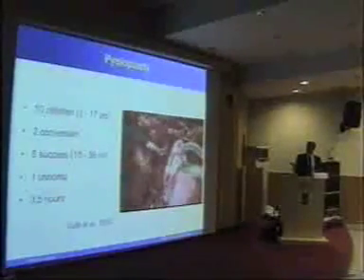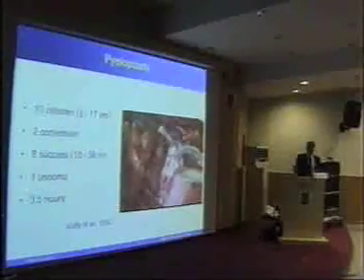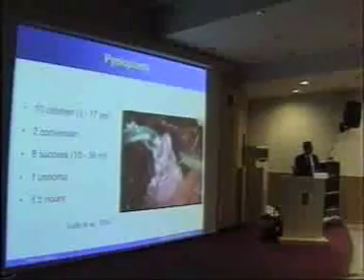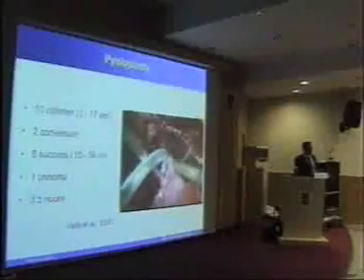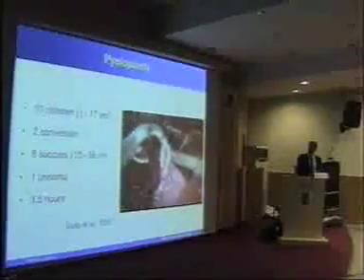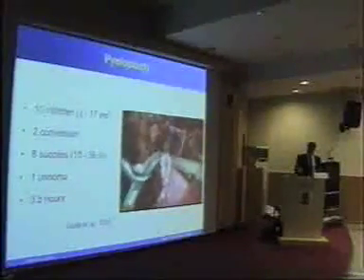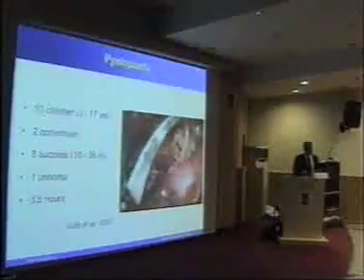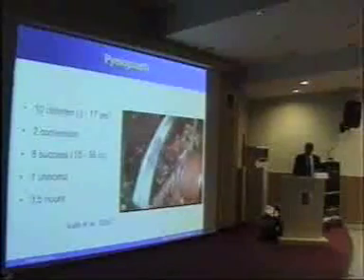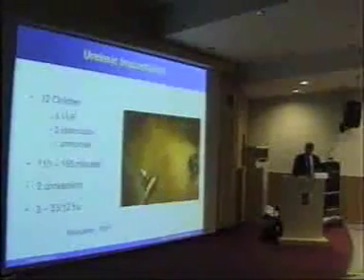He got 1 urinoma around it and uses a drain now to avoid that. And it took about 3.5 hours. It takes me about an hour and a half to do a pyeloplasty. Arguably one could do maybe 3 cases in the amount of time it took to do this one. So it's not for everybody, but it is developing, and I think with the robot that you'll see later, this is going to be an established indication for pyeloplasty as well.